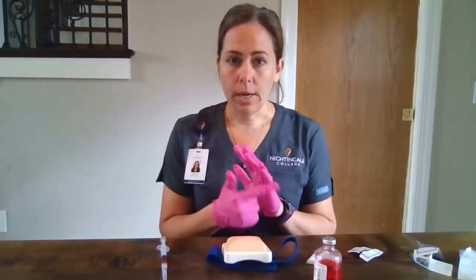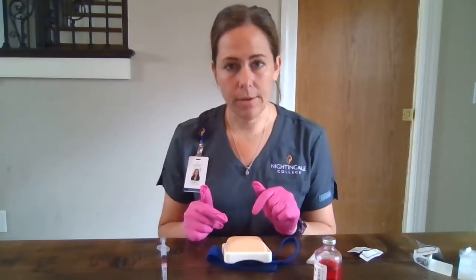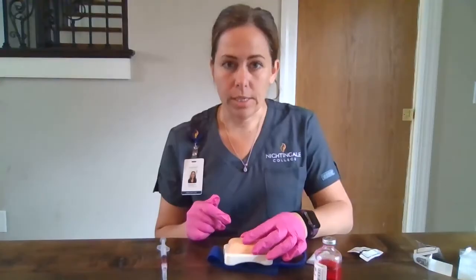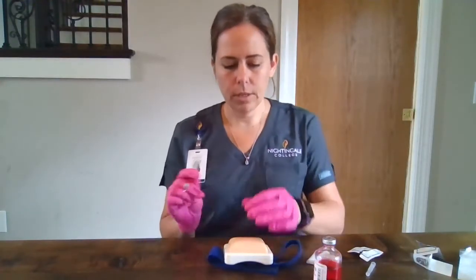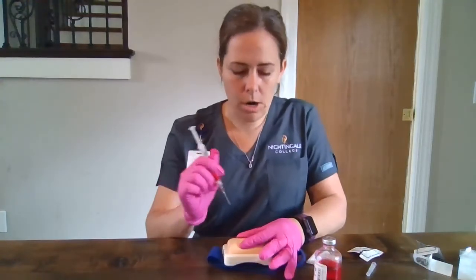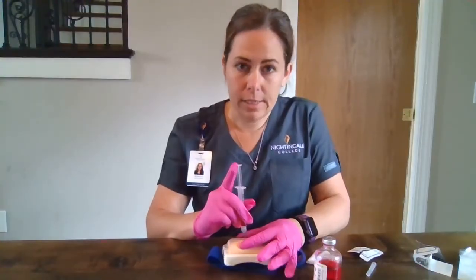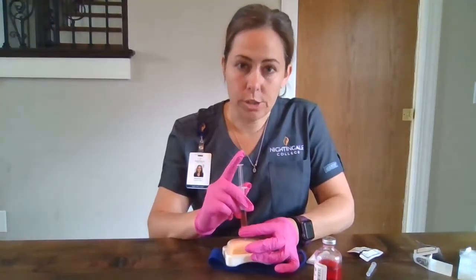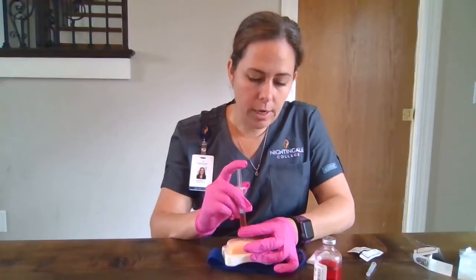Next, we are going to hold some traction using the ulnar side of our non-dominant hand, and we'll pull some sideways traction for that Z-track method. We'll also hold the skin nice and taut while we administer. So we're going to hold that skin, hold our lateral traction, 90-degree angle in. We can release our skin tension, and we will use those fingers to hold support on that needle. We will slowly inject our medication.